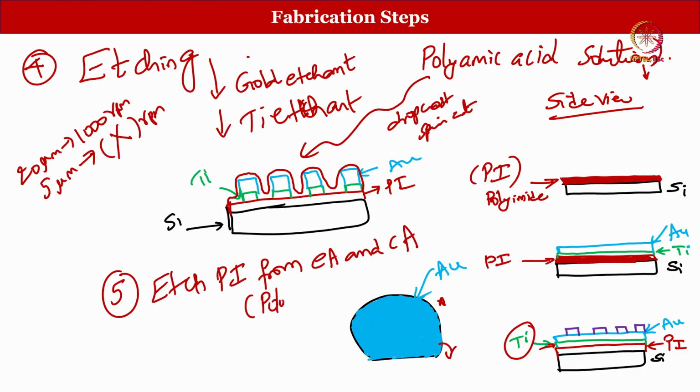This is called plasma Asher. So, again what you do? Again you do lithography, the second step. The first step we have done, and in the second step the alignment markers and everything come into the picture. So, again you have to spin coat photoresist, then heat it up a bit so that the solvent evaporates, then you get a photoresist layer there, then you need to expose it.